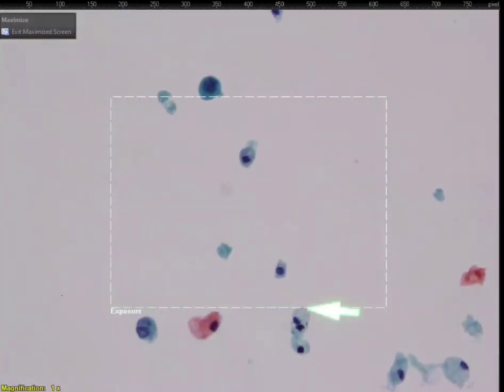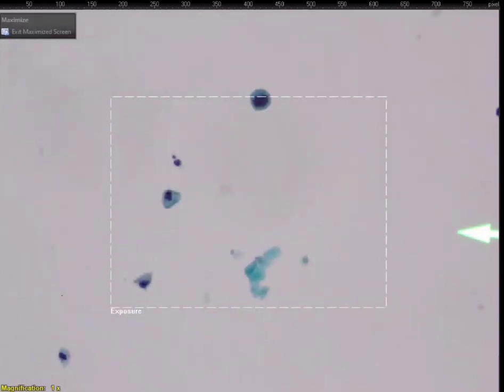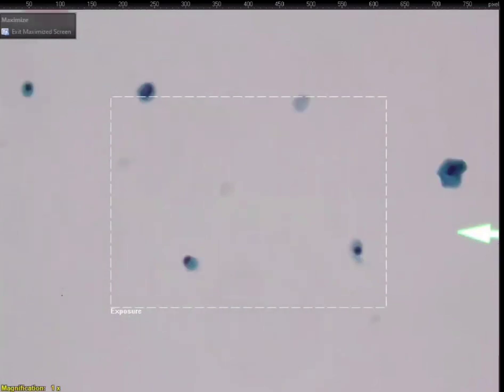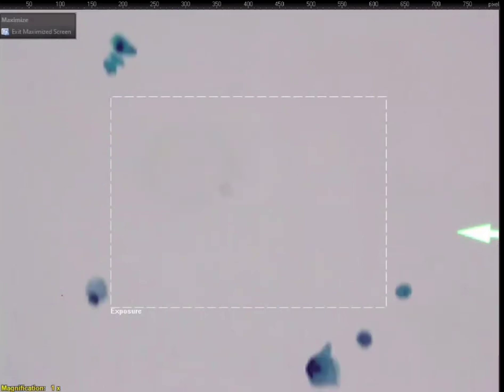Squamous epithelium, right? So when we look here, can you see these nuclei? It's not normal. So here's a small pyknotic squamous nucleus. It might look okay, but look at these other ones, right? High N/C, kind of open chromatin. I think maybe small chromocenters or maybe even a nucleolus, right? So if I look at these nuclei, I can see too much atypia in these squames. So it rules out that branchial cyst.